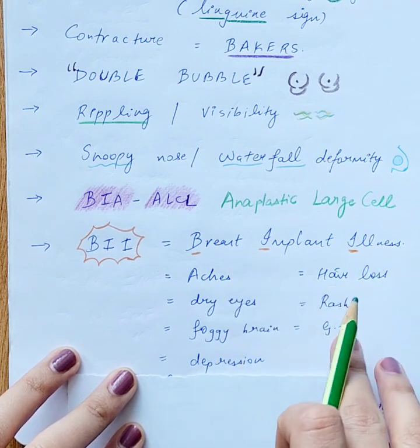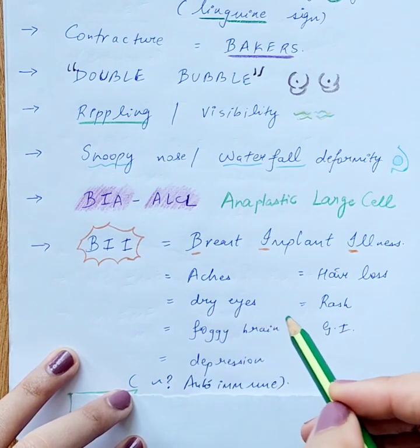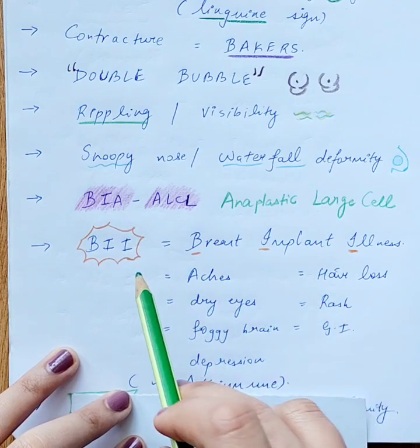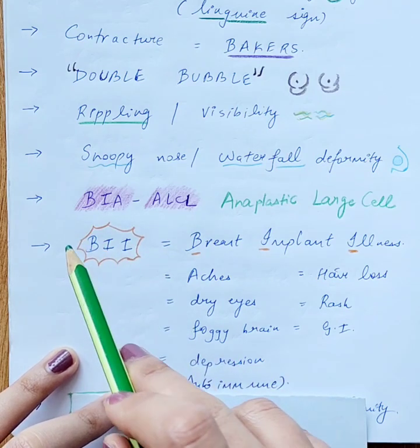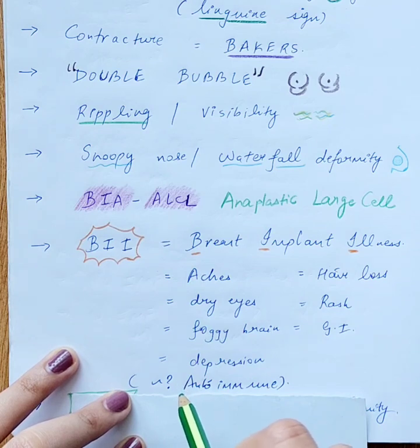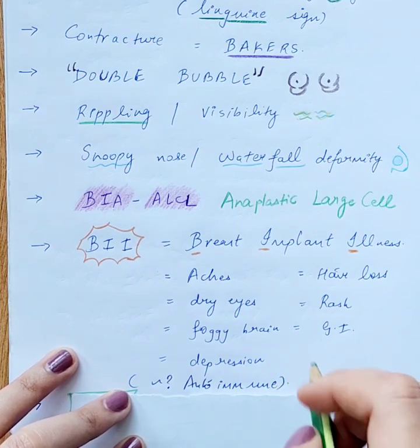They somehow appear to be like an autoimmune dysfunction, but the usual markers for autoimmune disease and the investigations prove negative. It has been known to occur a few months or years after the breast implant, and strangely enough, after removal of the implant, the patient gets relief from most of the symptoms. So that is known as breast implant illness. The exact cause is yet to be determined.